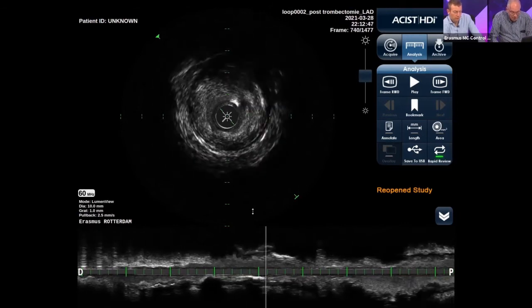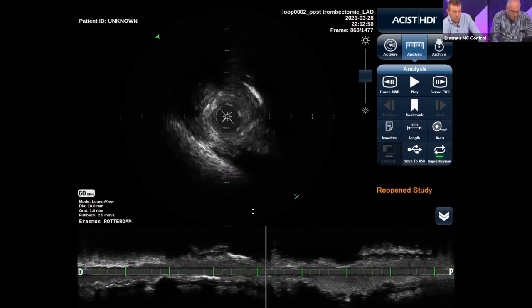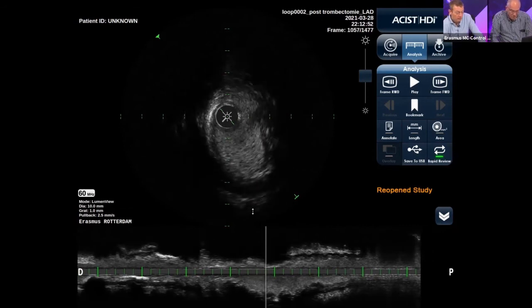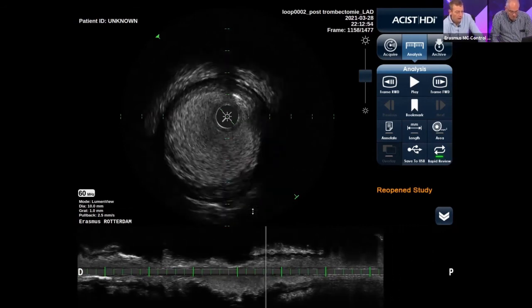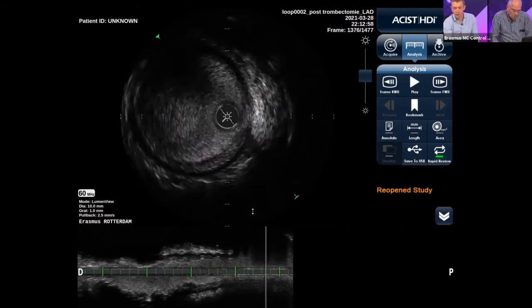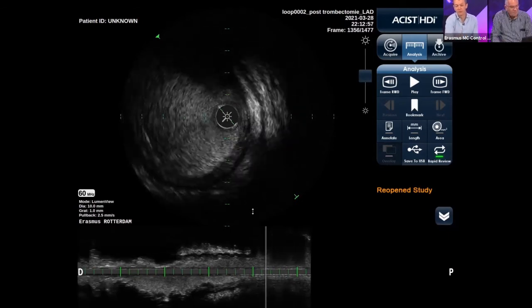That's a very important comment, Jurgen. So always think, like with any diagnostic modality you do within medicine in general, if you do IVUS, think, why am I doing this? Do I want to recognize the type of plaque? Do I want to identify how much calcium there is, which will then determine my treatment strategy?